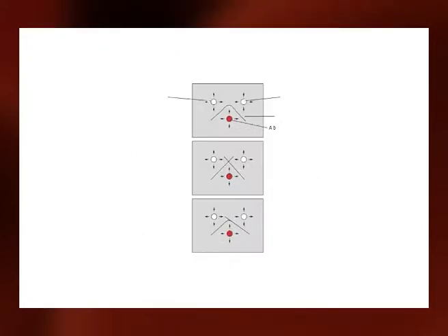In an assay in which 2 antigens are loaded in adjacent wells and an antibody in the third well, the following results can be observed. First, if the 2 antigens are identical, the 2 lines will become fused. This phenomenon is referred to as identity. If the 2 antigens are totally unrelated, the lines will cross each other but not fuse. This is known as non-identity.